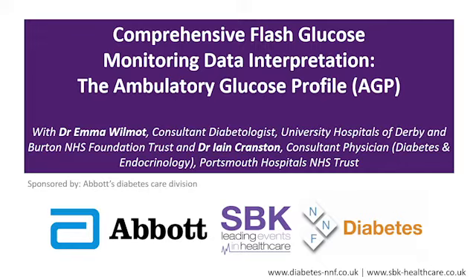I'm a great believer that most of the high precision diagnostics that we use in medicine are actually visual diagnostics. And whilst numbers are very straightforward, I think visual projections are far more powerful. And I think that's absolutely true of the data that you get from CGM and the AGP projection as a result. Yeah, I would completely agree. And although coefficient of variation data is there, for me it's a marker of hypo risk, and I've got that data by looking at the time below range and the ambulatory glucose profile. So in terms of my clinical decision making, it probably doesn't make a big impact, but I guess it's nice to have that there as a measure in line with international recommendations.